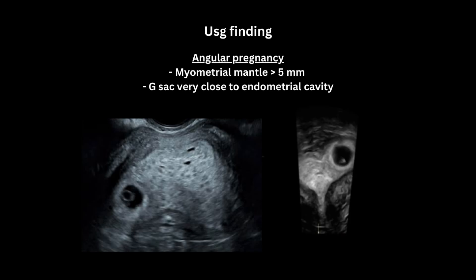On the contrary, in angular pregnancy the myometrial mantle is more than 5 mm and the gestational sac is very close to the endometrial cavity.